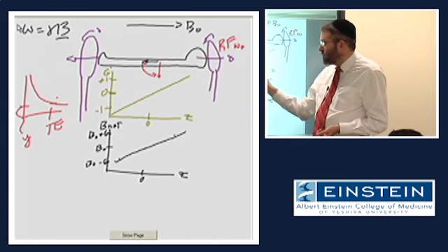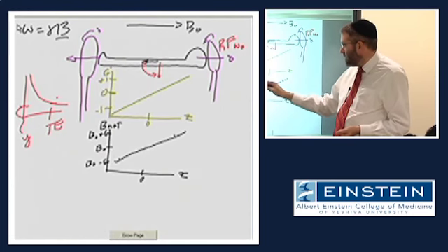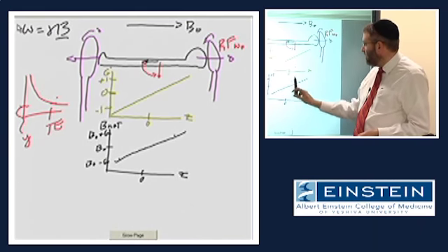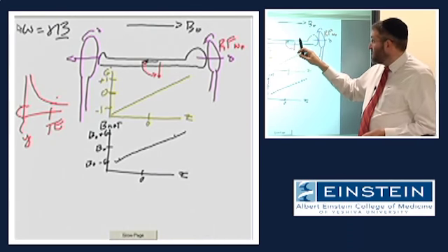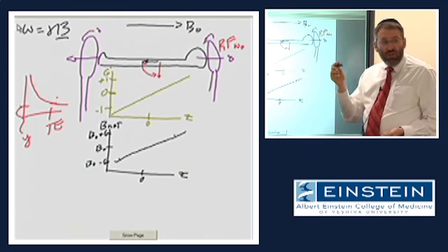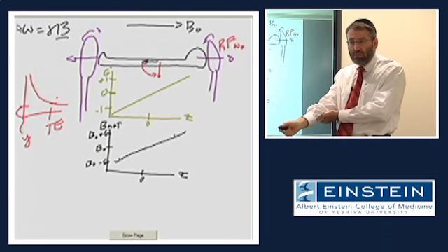Under the influence of this gradient magnetic field, spins at the isocenter experience the static magnetic field strength B0, but no gradient magnetic field strength, because by definition the gradient magnetic field strength is 0 at this location. Since they experience the field strength that matches the frequency at which we are transmitting our RF, they receive that efficient transfer of energy and they are rotated into the transverse plane.